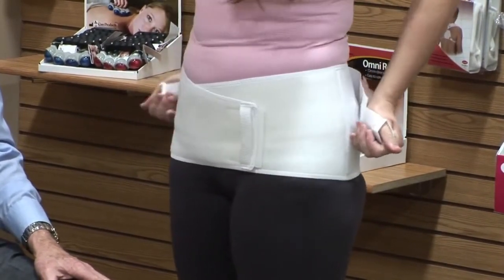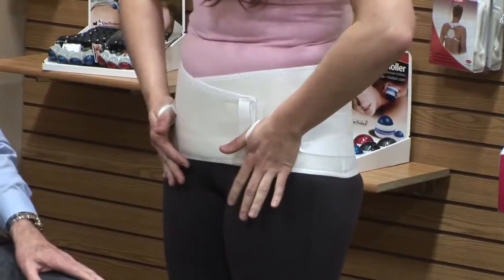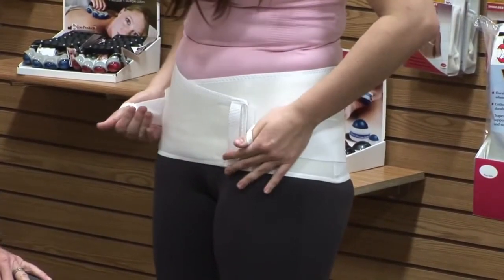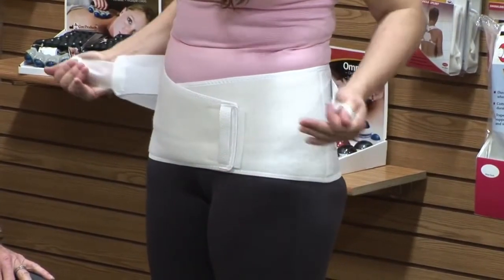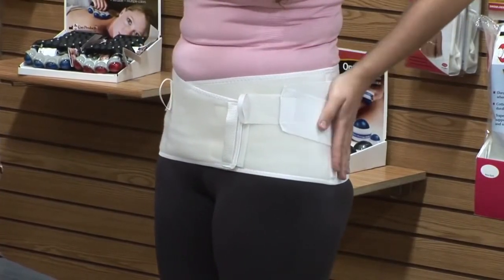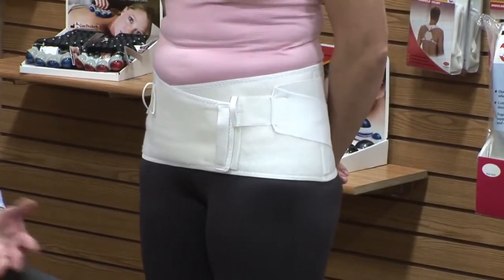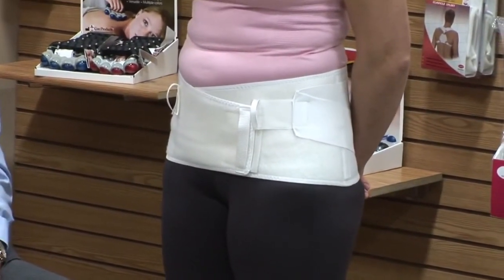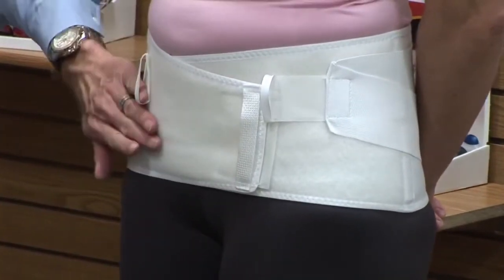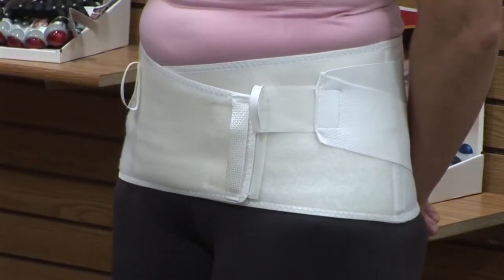The patient then uses the pull tabs or cinch straps simultaneously. She tries the straps low first to feel what support that provides, then tries them higher on the support — that tilts the pelvis just a little bit. Usually one position feels better than the other; typically patients feel more support with the tabs down low, but occasionally a patient feels better with them higher, so it's worth trying both.